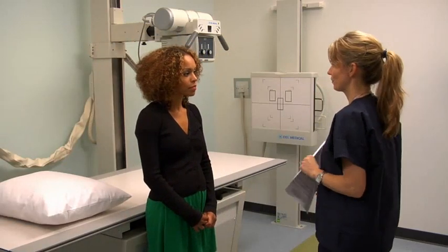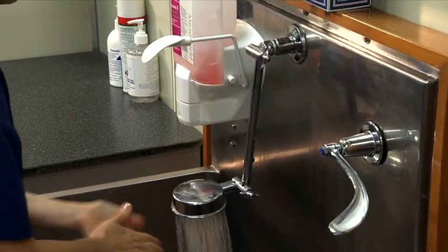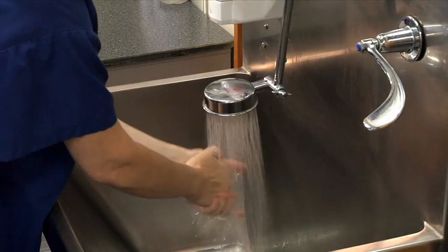Show the patient to the changing room and ensure that they are suitably clothed and not wearing any accessories that could obscure the radiographic image. Remember to wash your hands both before and after the procedure.